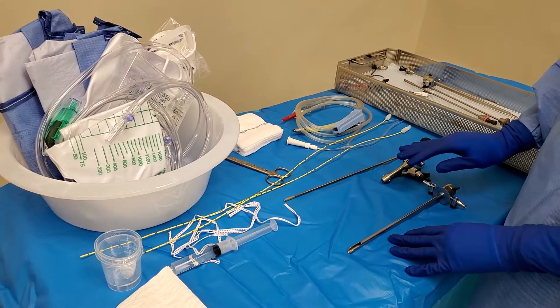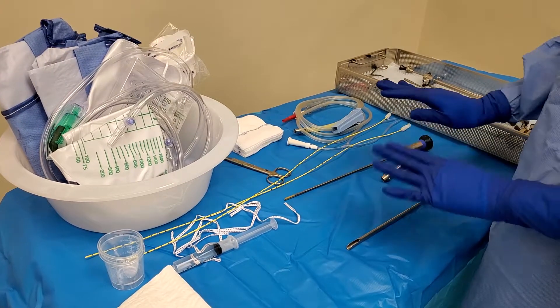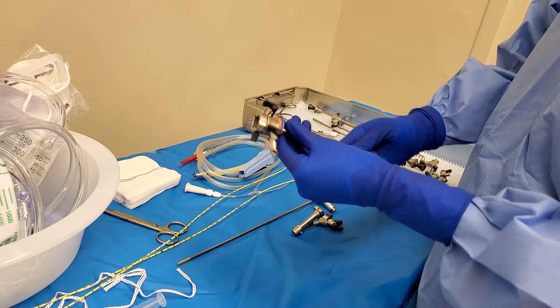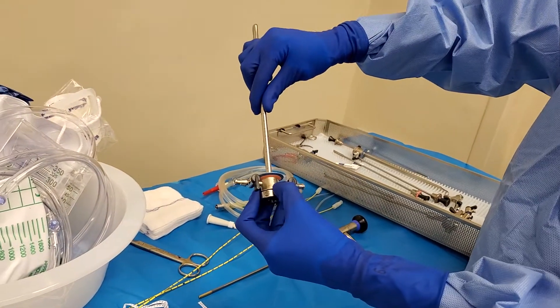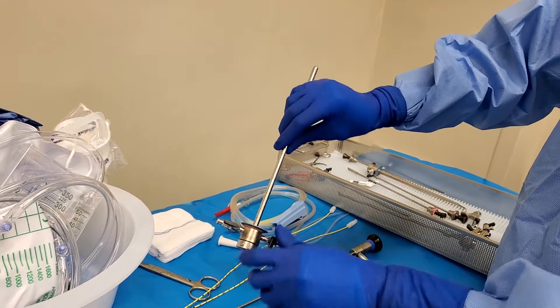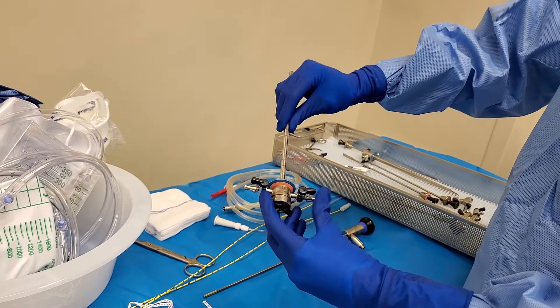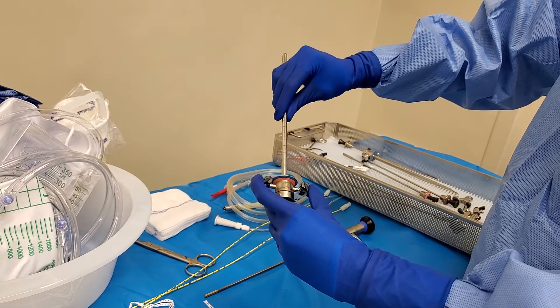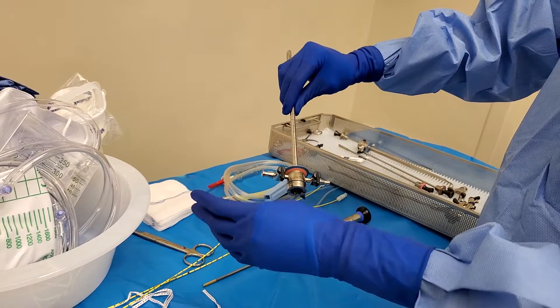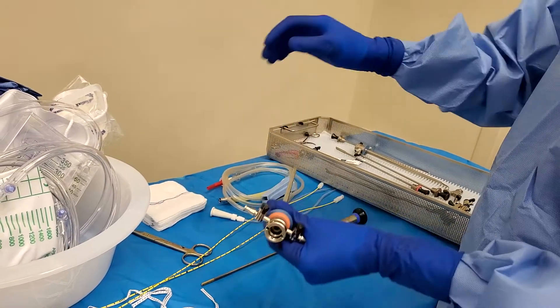All trays are different in every single facility, so I'm just going to show you the basic stuff. Most surgeons will use this number 21. It's hard to see because this thing is old. I like to just cut it off so that the water that goes in here doesn't just splash anybody. So I use number 21.